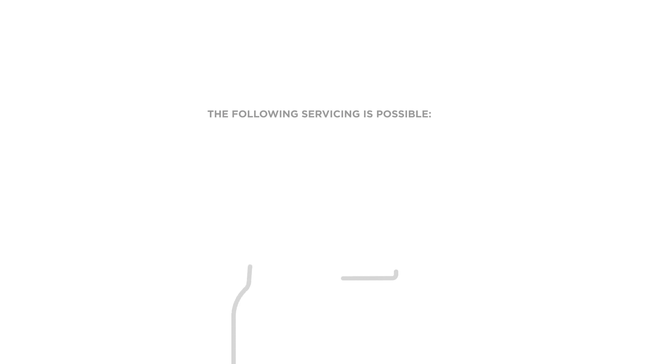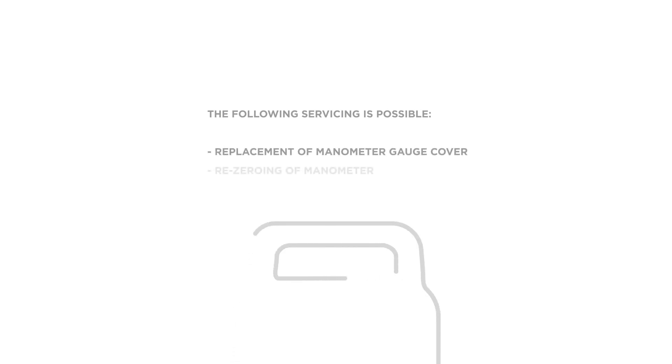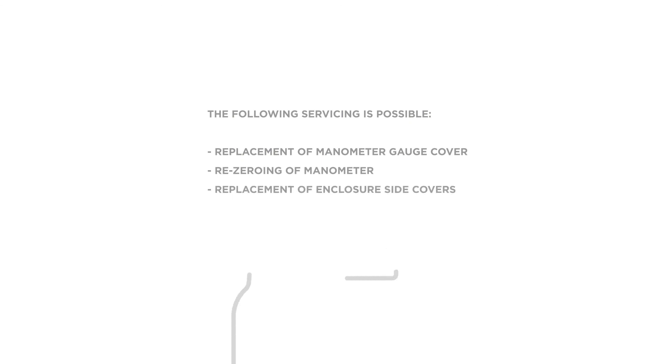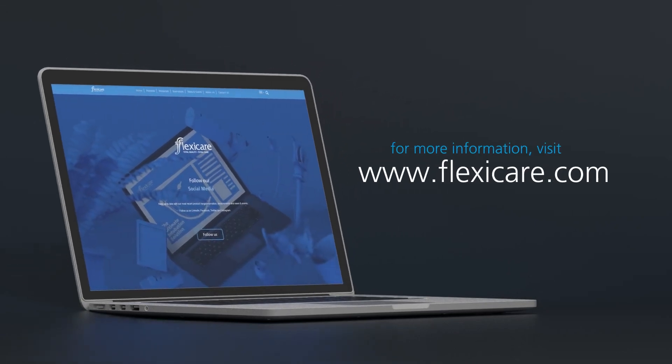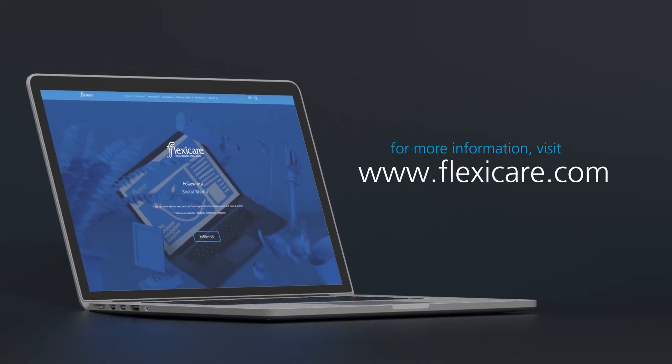The following servicing is possible: replacement of manometer gauge cover, re-zeroing of manometer, and replacement of enclosure side covers. For more information, visit us online at FlexiCare.com.